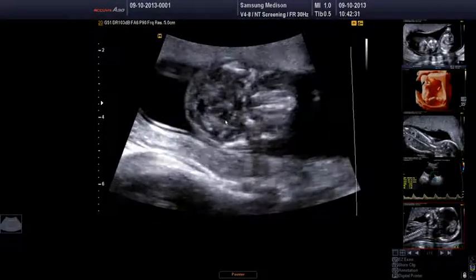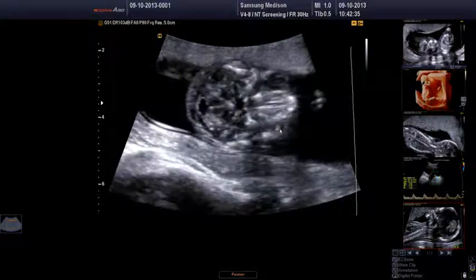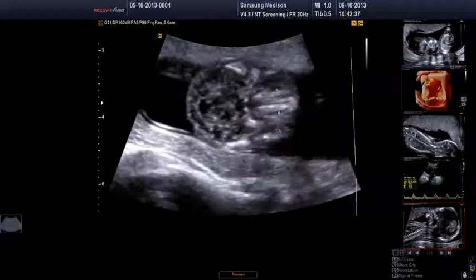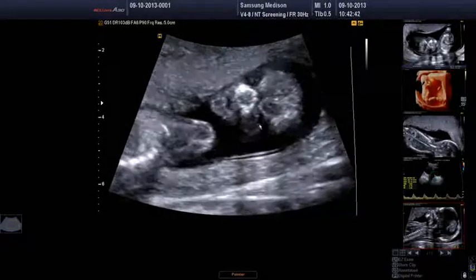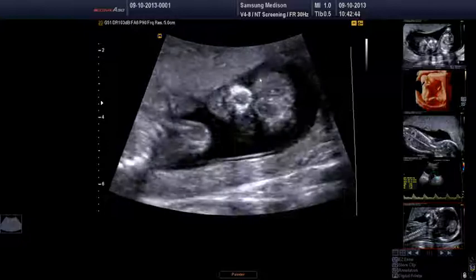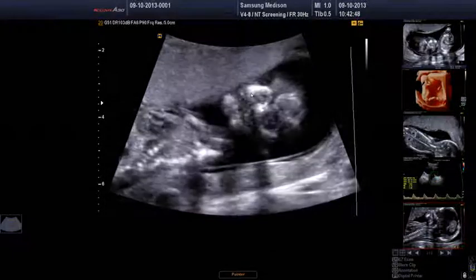Just as we work our way down, it's good just to recognize the two orbits, and you can actually see the lens of the eye. You can actually just turn the probe round and do that in a coronal section, so you can see the two eyes there. And in this section, you can just also examine the face.